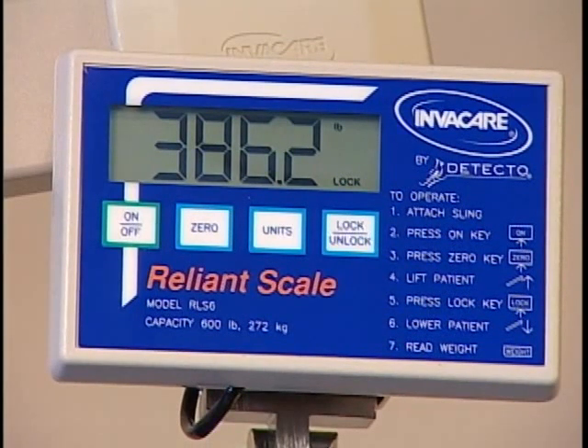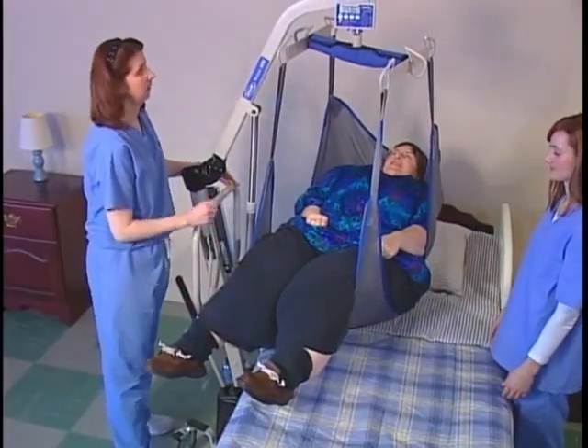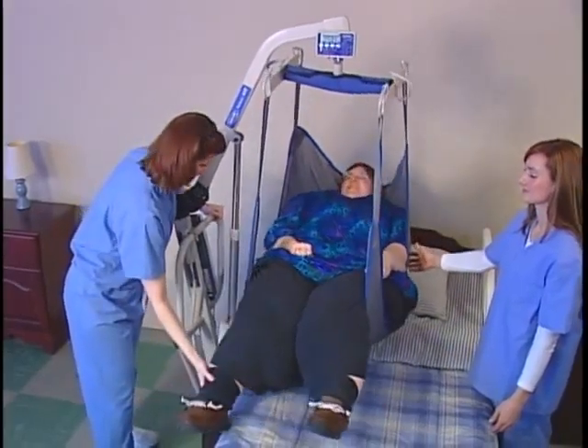The word LOCK will light up in the display window to verify that the weight has been captured. This reading will remain in the scale's memory until you press the LOCK UNLOCK key to clear it. To conserve battery life, the unit will shut off after two minutes of disuse, but the LOCK reading will remain in memory until you clear it.